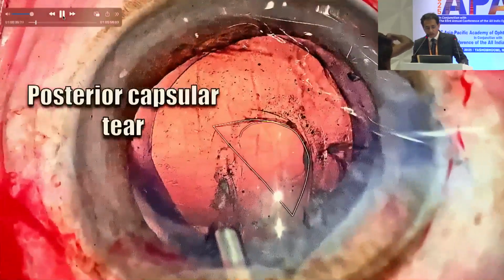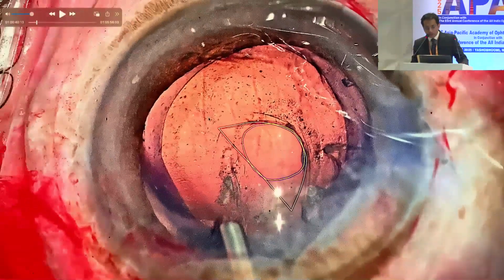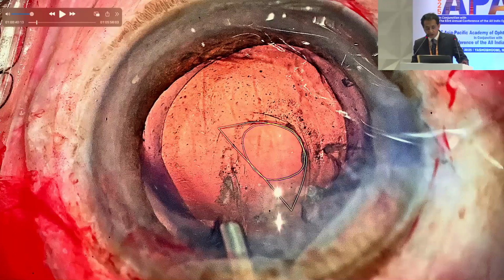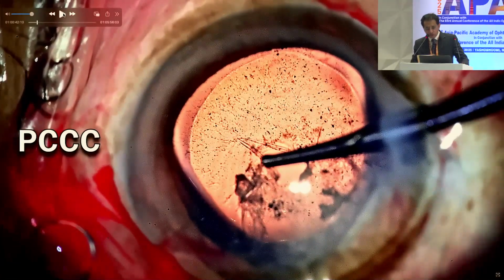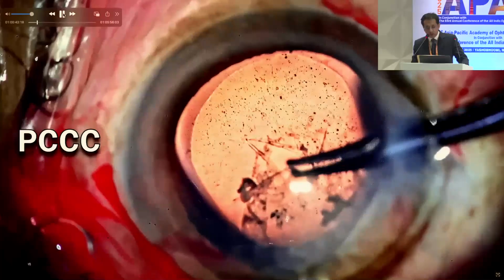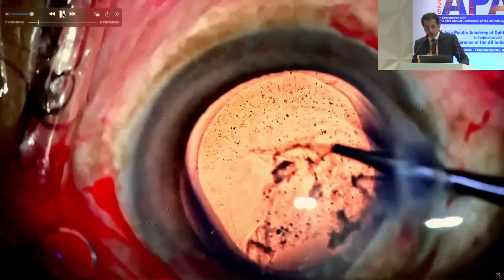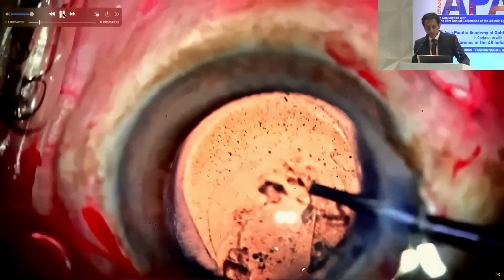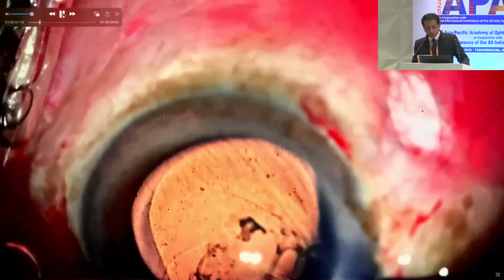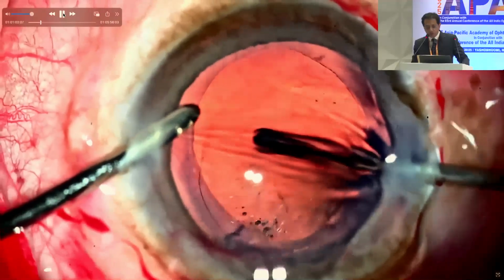In this case, the anterior hyaloid was ruptured, but the vitreous prolapse had still not happened. We can clearly see this round circular thing, which is the anterior hyaloid rupture, and this is the posterior capsular tear here. At this stage you push in OVD to push back the anterior vitreous face and then perform a posterior capsular rhexis. If the vitreous has already prolapsed, you cannot do the posterior rhexis now; you have to perform vitrectomy first and then the posterior capsular rhexis. But if the prolapse is very minimal, you can push it back with the OVD, perform the rhexis, and then perform the anterior vitrectomy.